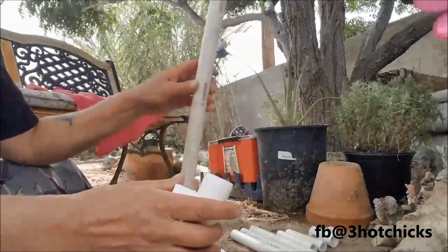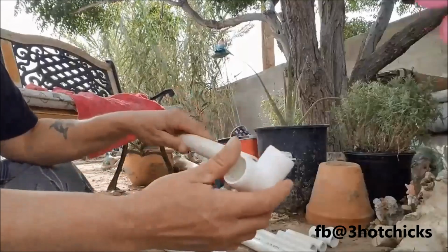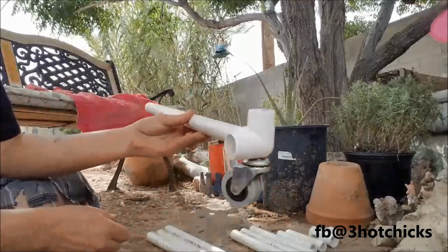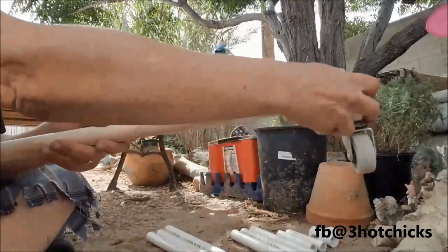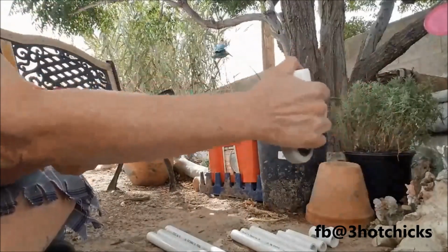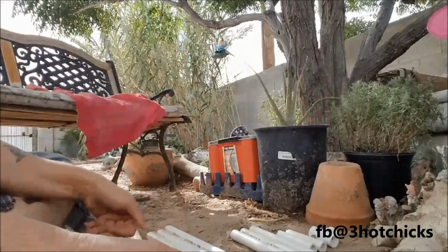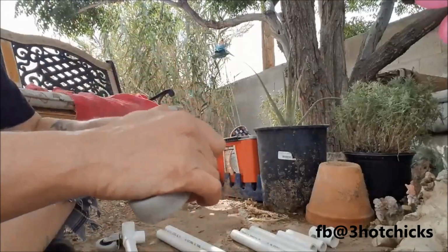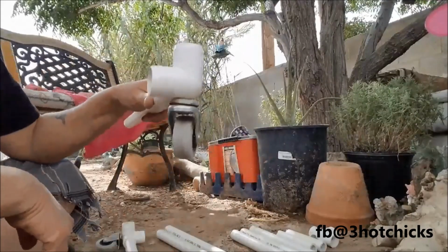So I've got 2 pieces that are going to be the length, and put 1 piece in here. So there's 1 length, and then the other wheel is going to go on the other side. So there's 1 length. And then I'm going to take another one and do the same thing. But you want the wheels on the bottom.